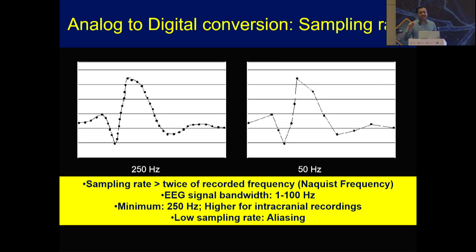Now, regarding sampling rate, I have very commonly seen that the supplier tells you 240 hertz, but when they install the machine, they set the sampling rate on the lower side. What will happen is that if your sampling rate is low, all the artifact will become smooth. So when they are trying to sell you the EEG, they say that their EEG waveforms are very good, there is no artifact, and it is recording very properly. This is a very common scenario because many neurologists don't understand this.